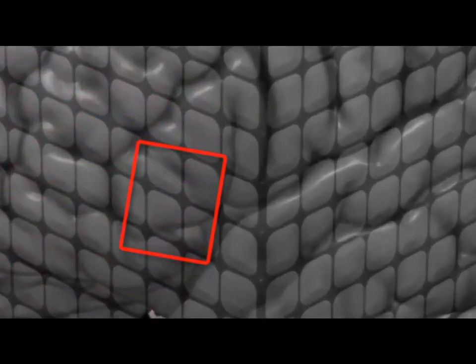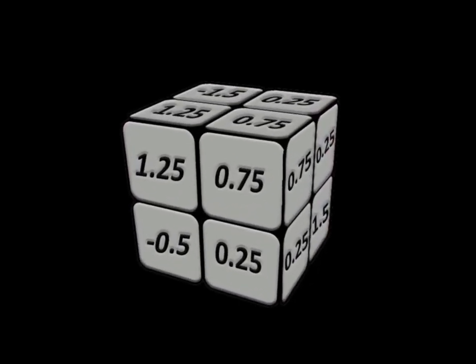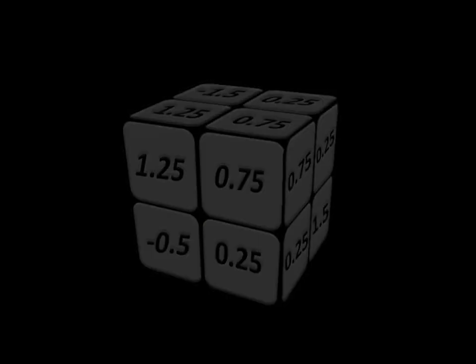Now, if you zoom in on all these different voxels, remember it's our smallest spatial resolution element. They contain a different number, right? So in this voxel, it's 0.75, over here 1.25. That is, at that particular time point, what the signal was in that voxel. So you'll see these things called time series later on, very important, which shows how the numbers in each of those voxels varies over time.